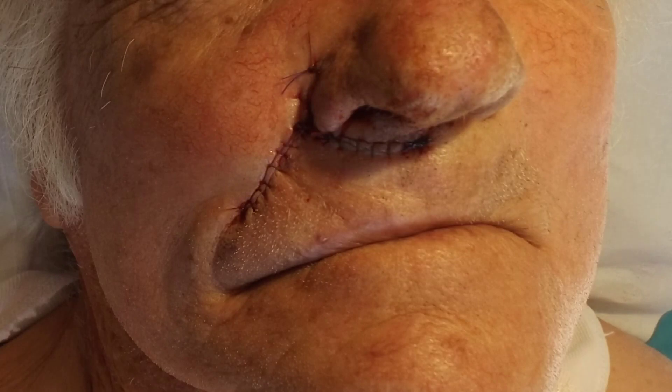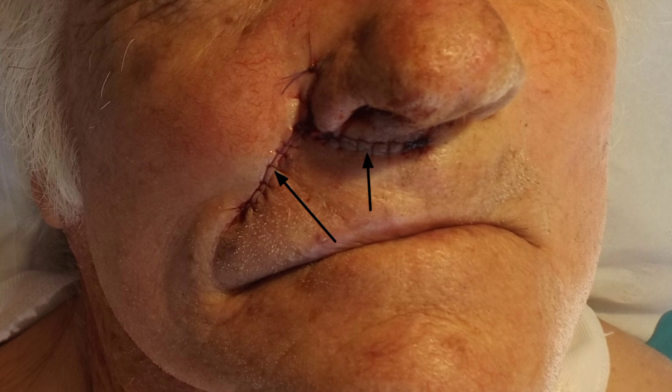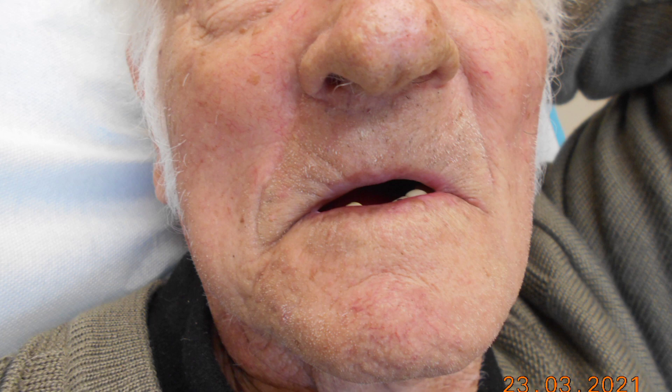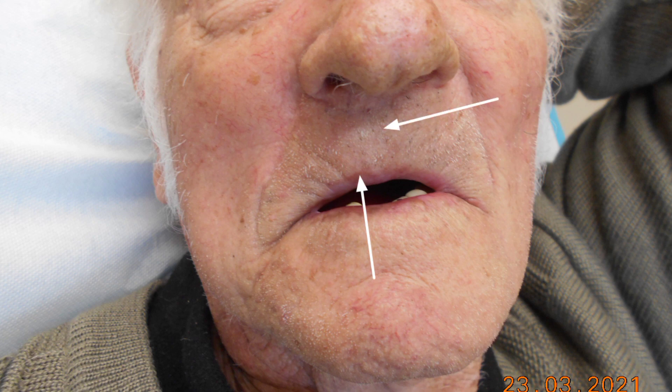Suture lines were hidden in the nasolabial crease, then below the nose and around the right nostril. The wound healed well and there is quite an acceptable cosmetic outcome — the upper lip has not been distorted and the philtrum is in the correct position.